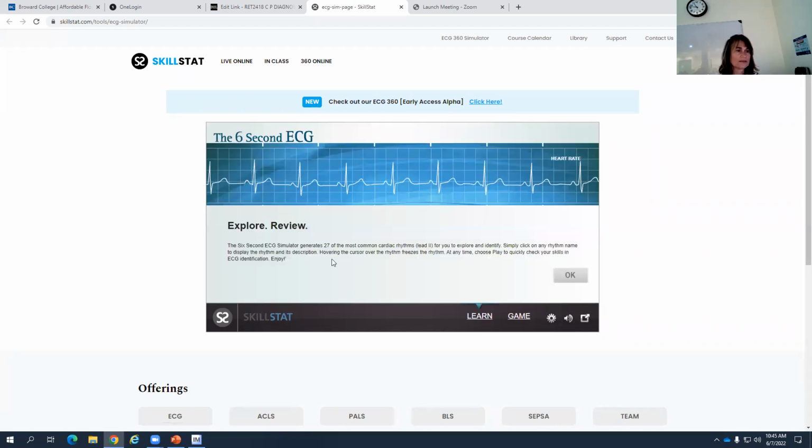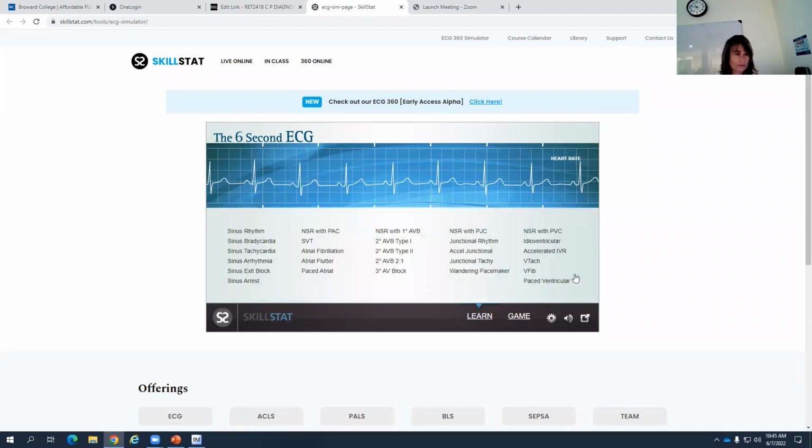If you're just learning, it has 27 of the most common cardiac rhythms. Have we learned 27 already? I don't think we learned that. Well, let's see. Sinus rhythm, yes. Sinus bradycardia, sinus tachycardia. These three, no. I kind of mentioned them a little bit, but not too much. Okay, normal sinus rhythm with a PAC. Did I mention premature contractions? All right, what about SVT? Yeah, atrial fib, atrial flutter, paced atrial.